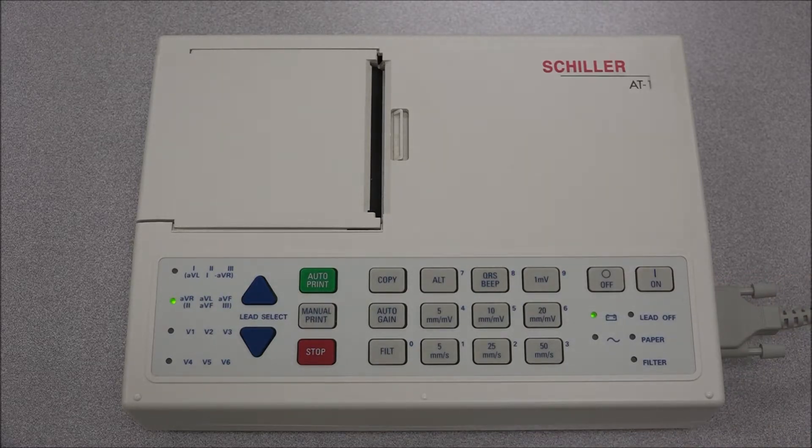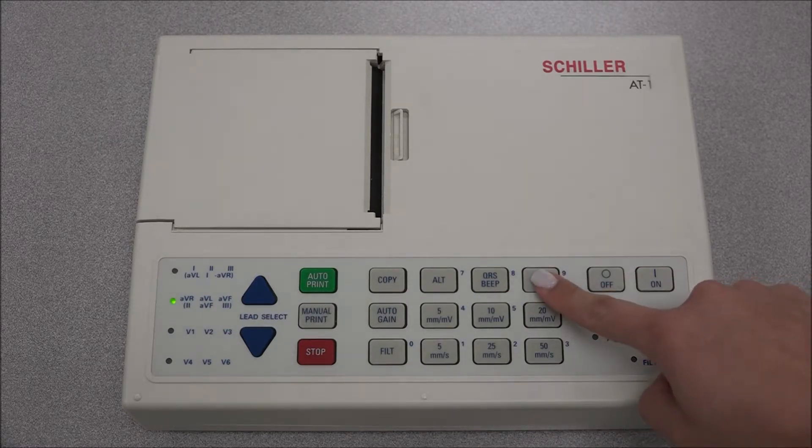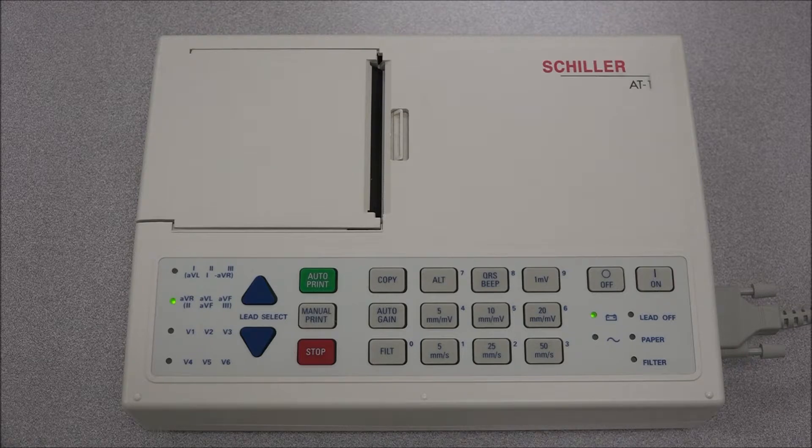The 1 mV key can be pressed at any time throughout the recording to mark an output and is used for baseline re-centering. The QRS beeper key will enable or cancel the QRS beeper. The auto gain key is used for the automatic adjustment of the ECG in order to avoid overlapping traces.